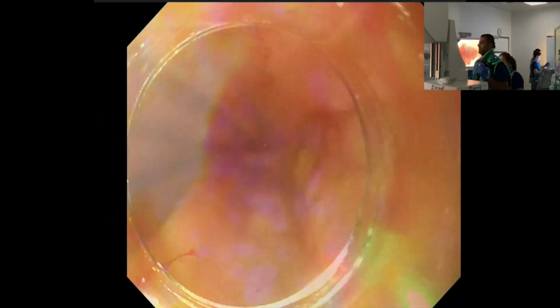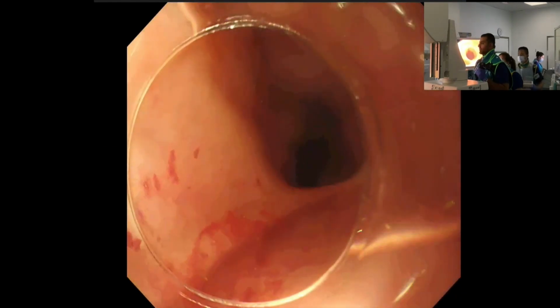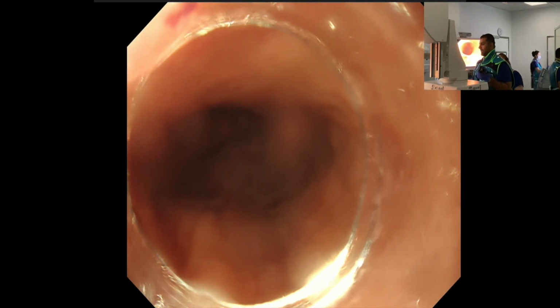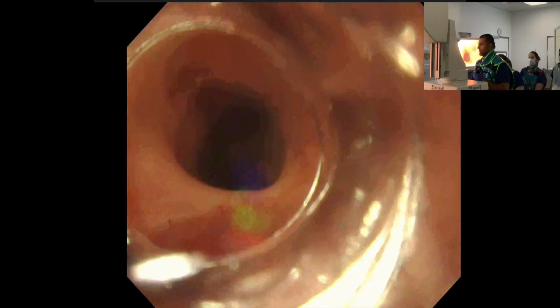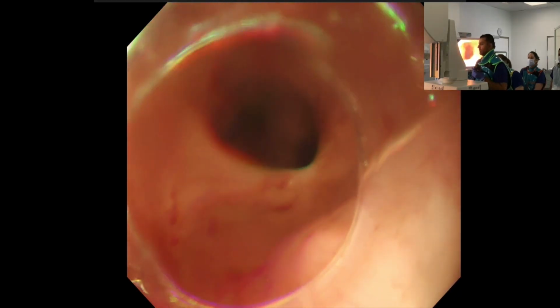This is the first of the etiologies. His second, more chronic pathology is this here, which is a simple stricture, but this is caused by previous tracheoesophageal fistula repair at birth. And interestingly, although he has got symptoms of regurgitation and reflux, this proximal dysphagia is what causes him the most symptoms. So we dilated him with a 16mm bougie, and this has been previously dilated with a balloon, and he's had very little symptomatic relief. So what we're going to do today is actually try something slightly different, which is something called a stricturotomy.